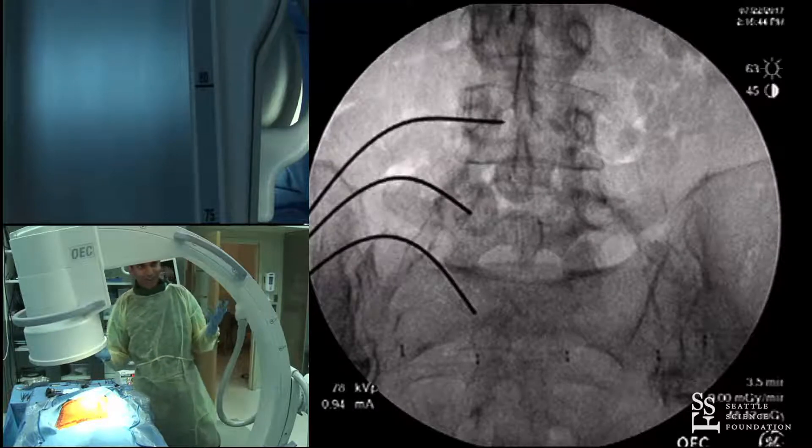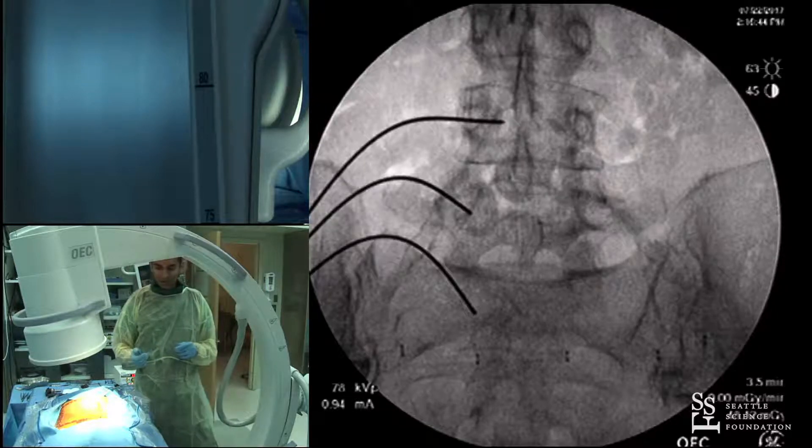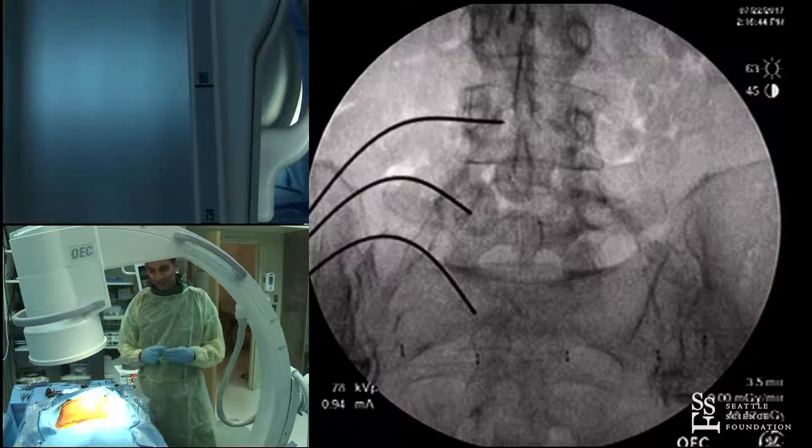Looking at this, the guide wires are nicely placed — the navigation worked to its ultimate. For rod passage, nothing novel here, but I'll share my tips on longer constructs.